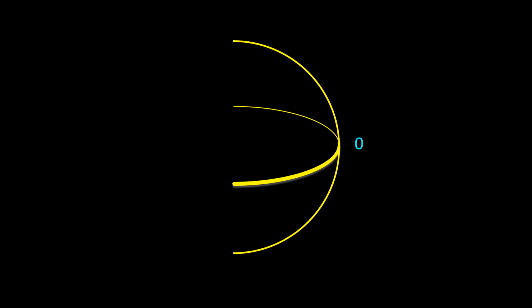In this frame, you can see the curvilinear yellow lines representing the back of the ocular sphere. The white line I have just introduced represents 1 degree. 1 degree is equal to 60 minutes.